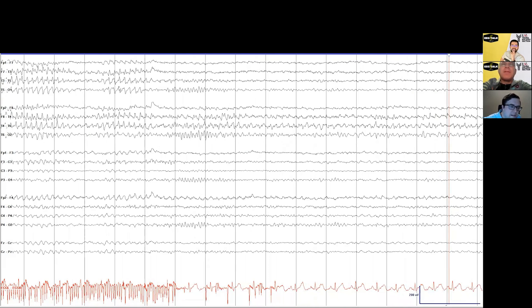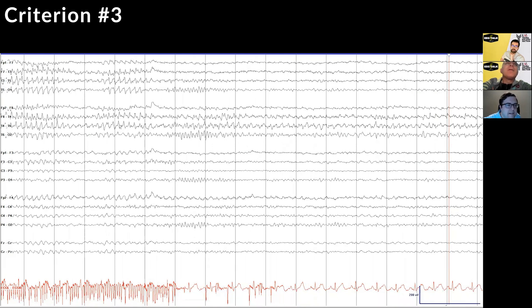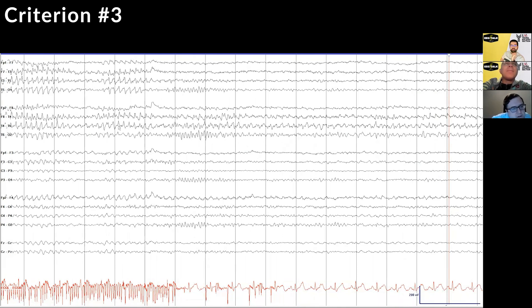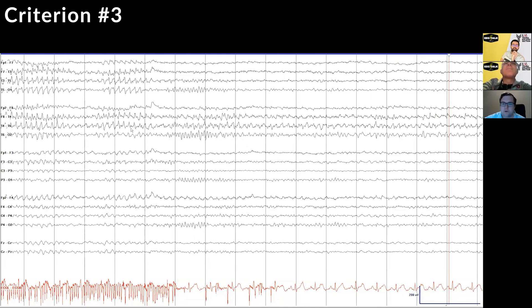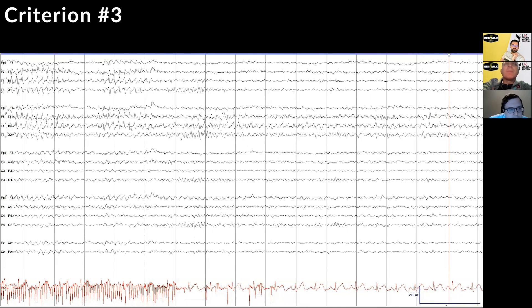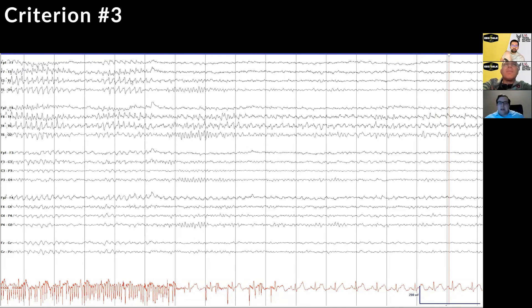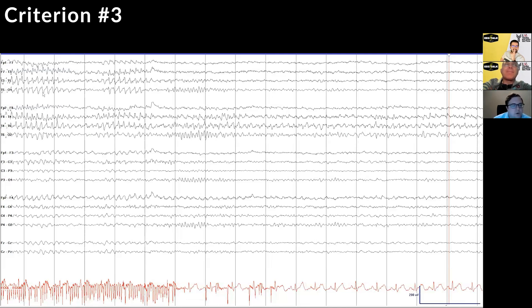What do you think? Well, in this case though, the background is, it's all this stuff. I'll help you. This is an ongoing rhythm of some kind. Sort of blends in and out. Yeah, so no points there. Just one, I'd say, probably not. Okay, third is the symmetry. I think it's asymmetric. I think the upgoing slope is steeper than a downgoing slope, so one point. I don't know, I think it's two separate waveforms you're seeing there. I think you see a theta wave and then there's an alpha wave on top of that theta wave. So each individual wave to me looks pretty symmetric. It's just that sometimes you have one wave on top of the other wave, so that combination of two looks asymmetric. And that's what's been classically described with this as the notched appearance that sort of starts sloping up and then rapid uptick. Superposition of some theta and alpha waves. Yeah.